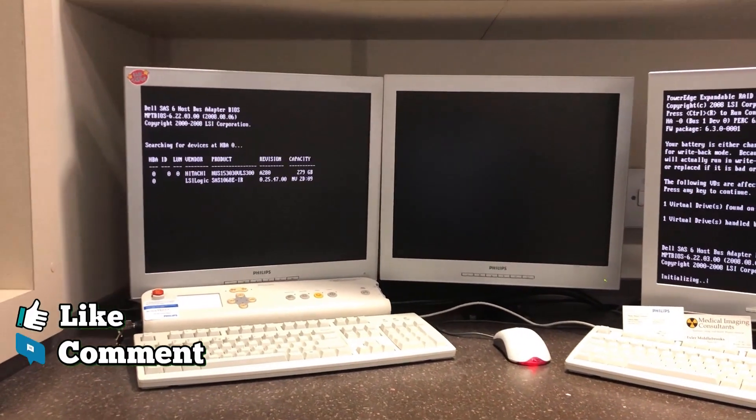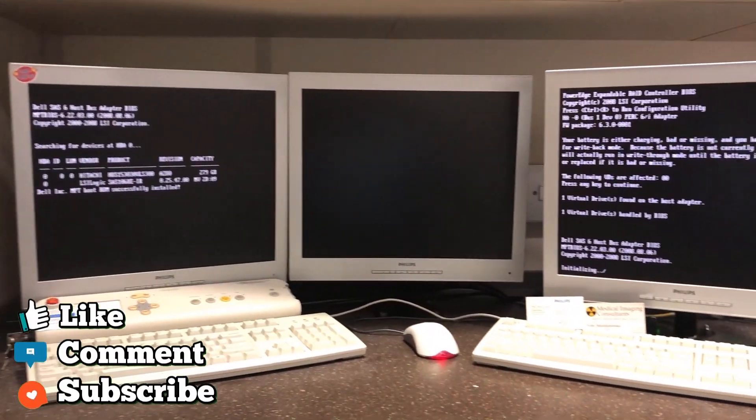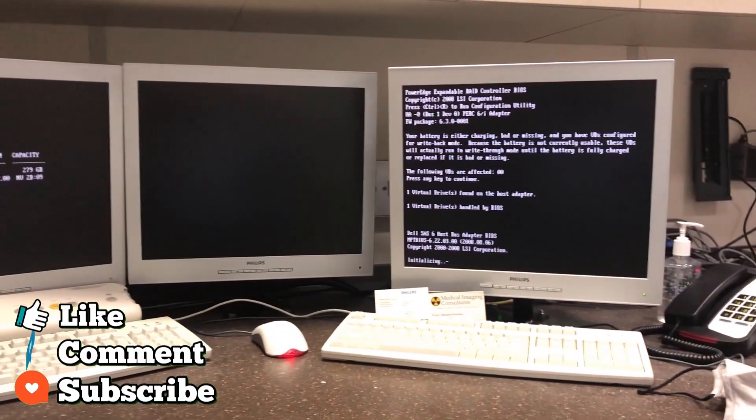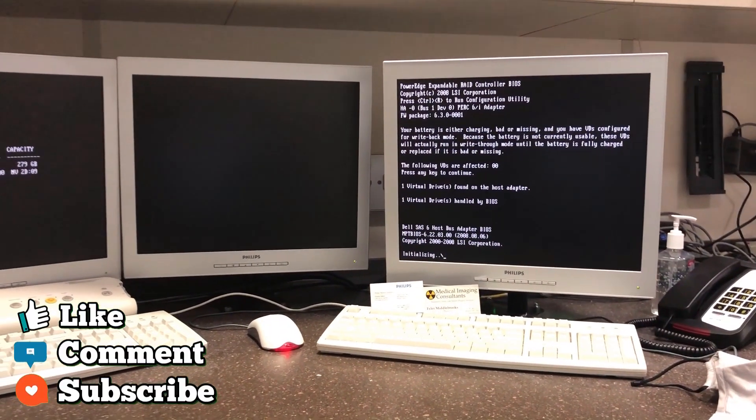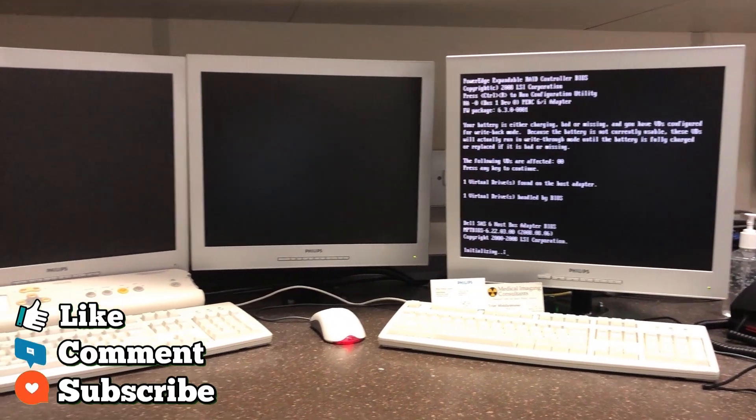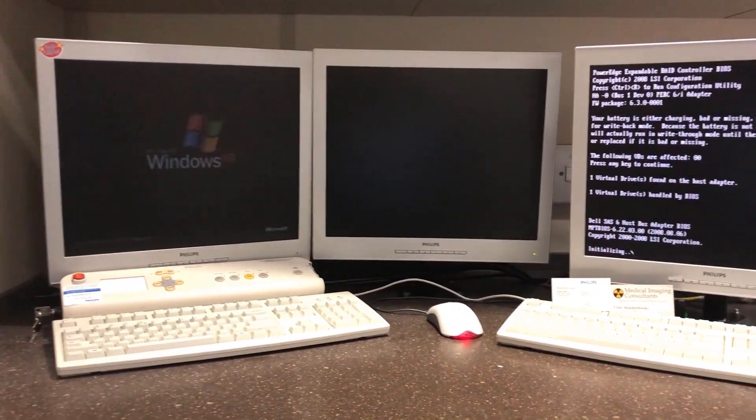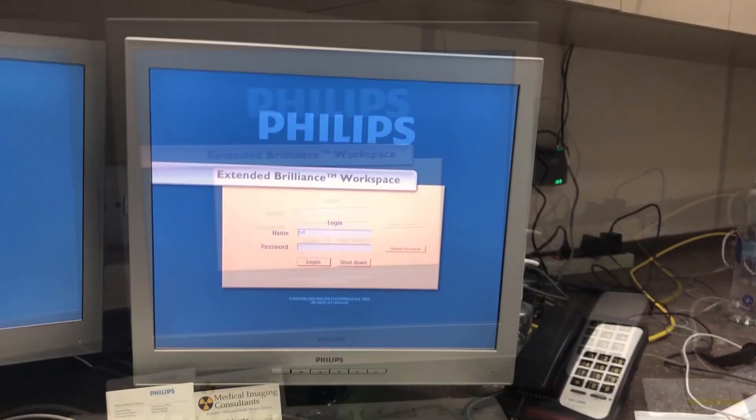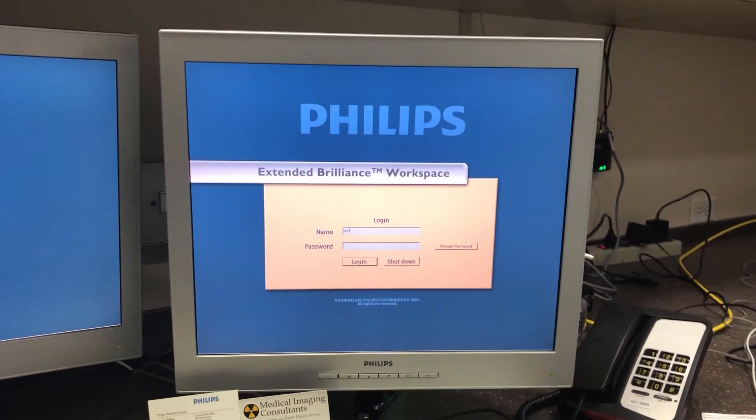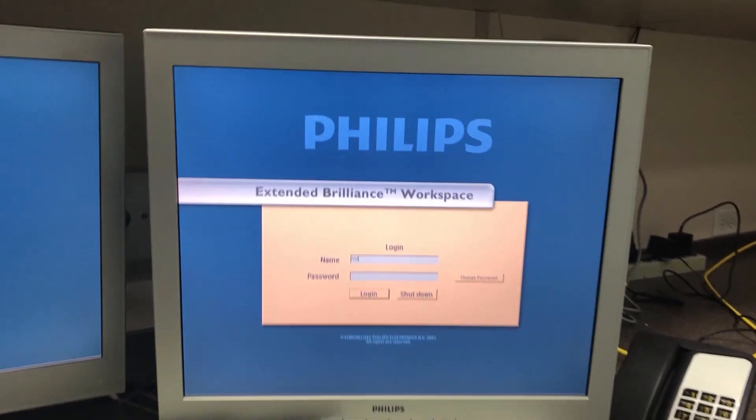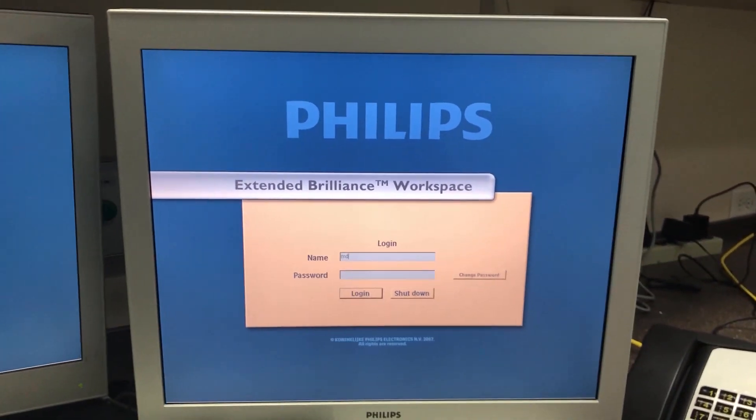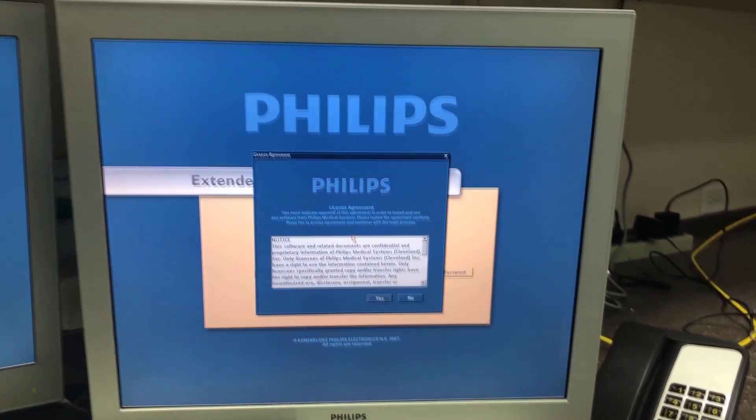So after just a couple minutes, both the CT and pet CT host are starting to boot up. After just a couple minutes, the pet CT host is up and ready. So we're going to log into the pet host.